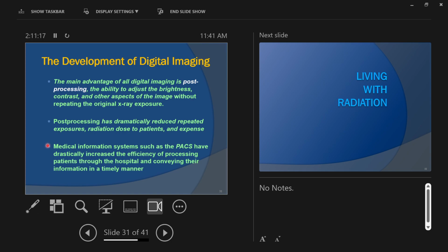When it's film like this, I make the X-ray, I give it to the ordering physician, right? But if the radiologist wants to look at it, what has to happen with this? You've got to process the film, right? Let's say I've got it on the view box for the ordering physician. The ordering physician gets to see it, but now they want to send it over to the radiologist for final report. We literally take it to the radiologist, who's down the hall, who cannot be off-site. They have to be in the building because this is in the building, and this is the only thing.